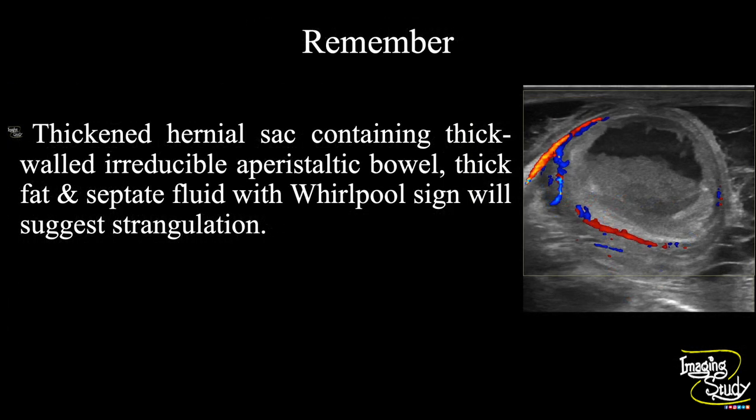Now the take-home message: a thickened hernial sac containing a thick-walled, irreducible, aperistaltic bowel with thickened fat and septate fluid, along with whirlpool sign on color Doppler, will suggest a hernia as a strangulated one.